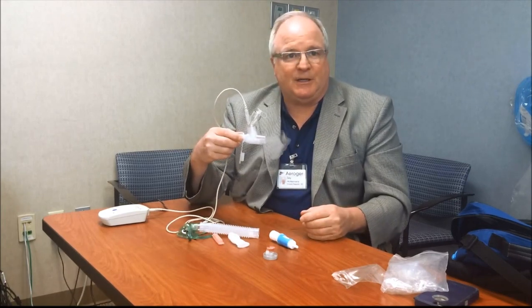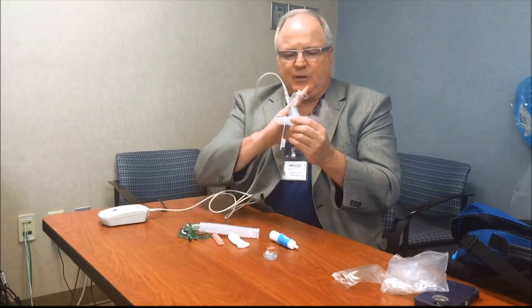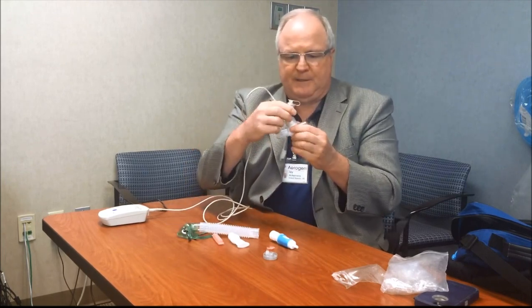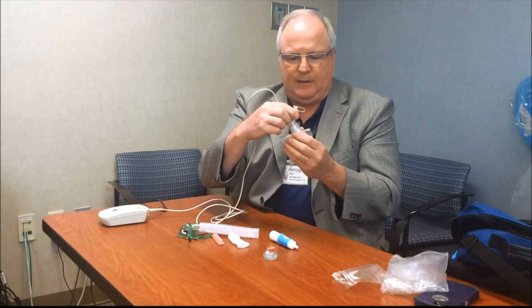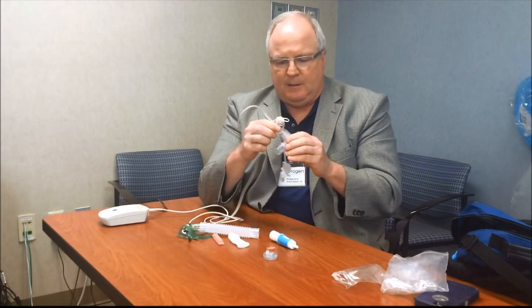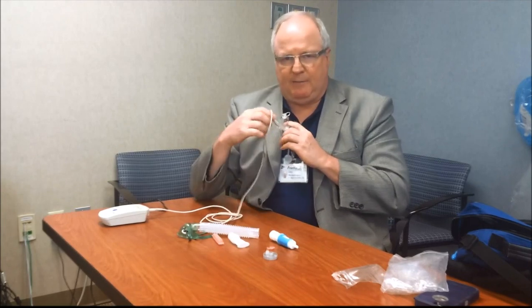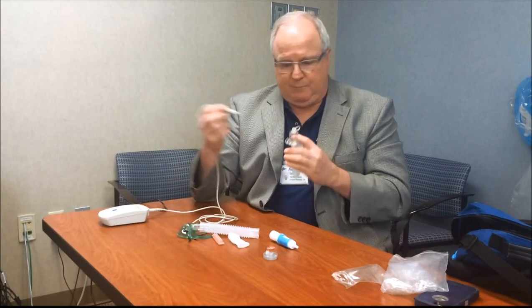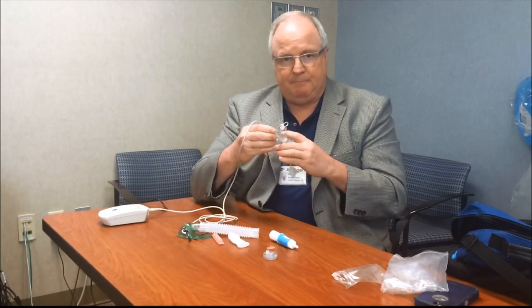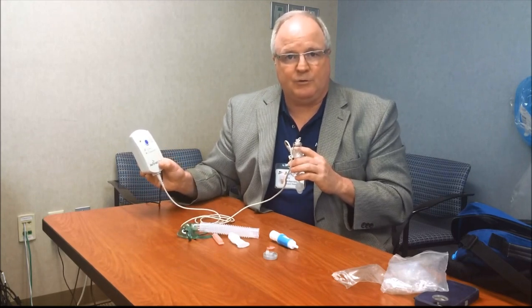I think that's pretty much it as far as most of the information. Just in review, basically make sure you have the best angle with a T-piece, so depending on what modality you're in, you can always move this because it's a friction fit. If you do have it up close to the patient and you want to avoid extra cables, you could always unplug this between treatments and just plug it back in. And then keep in mind, you want to keep this plugged in whenever you're using the technology.